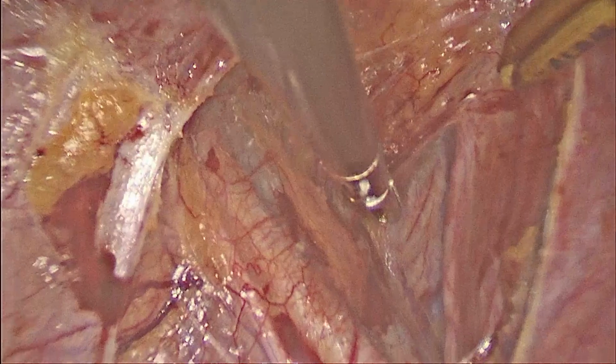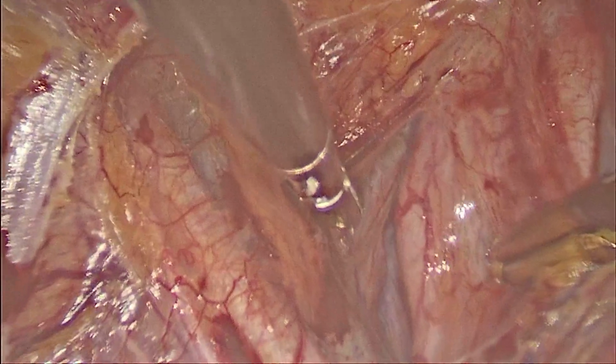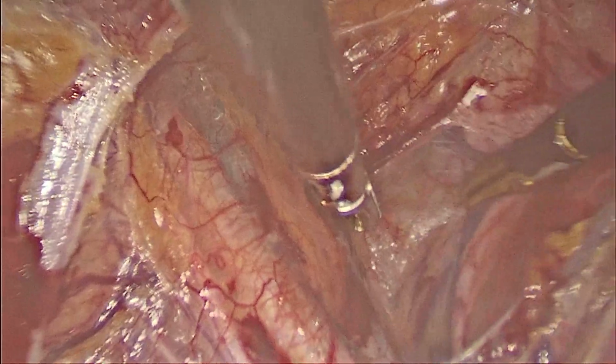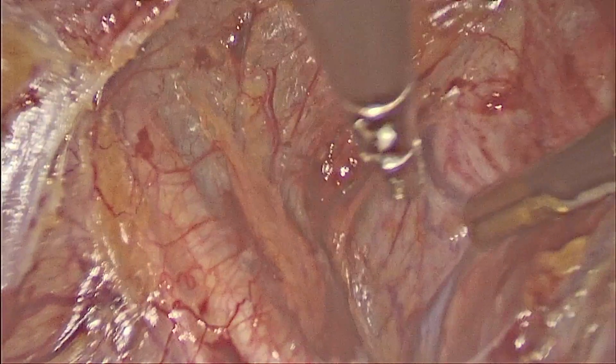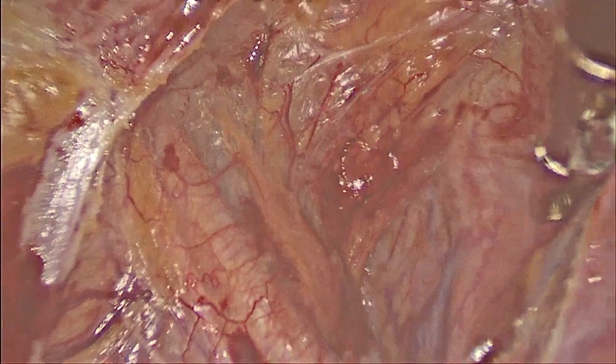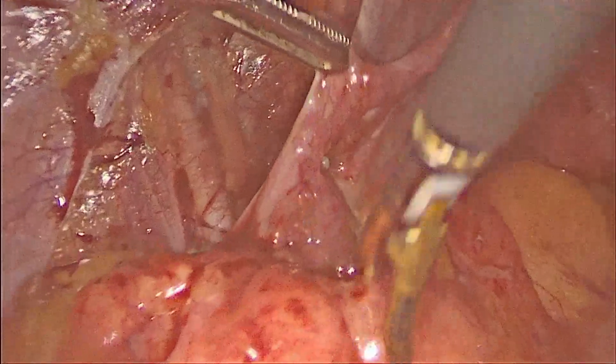That is the uterine artery, where I am separating it from the ureter in the left hand, and that is the peristalsis which confirms that it is the ureter. So identifying the ureter throughout its course is a very good way to prevent injury to it.